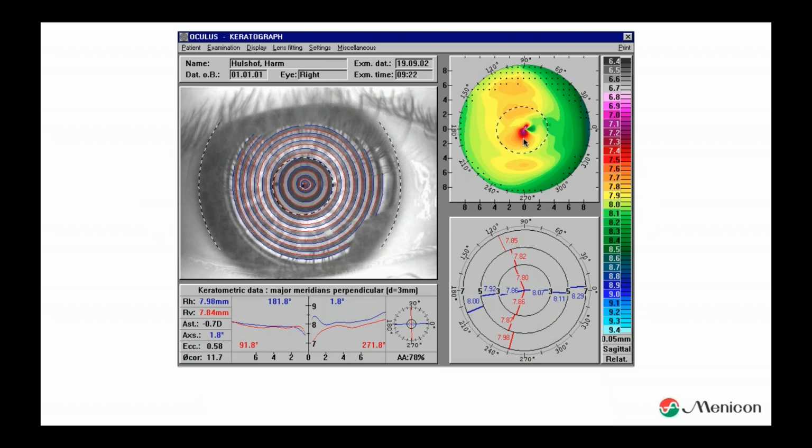And a good example of that is this. This is from an Oculus topographer, and what you see in the center is wrong. You see it's a relatively flat eye, but in the center part, it's steep. Well, then you can think, okay, whoa, it's a kind of nipple cone. It is not. It's just a mistake made by the topographer. Because in the center, there's the measuring device. In the center, honestly, is the camera as well.